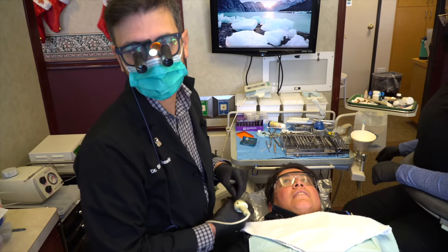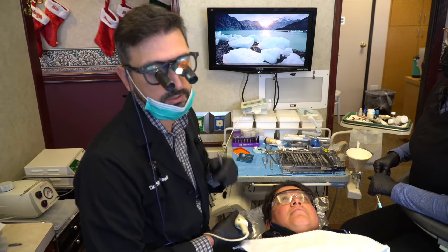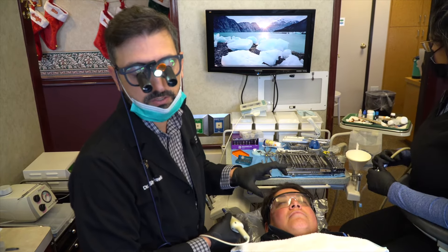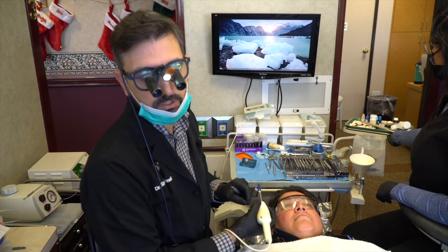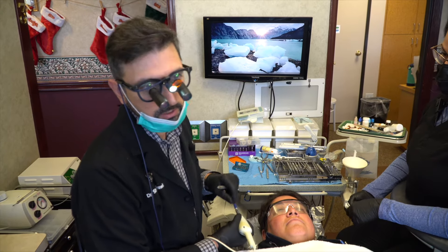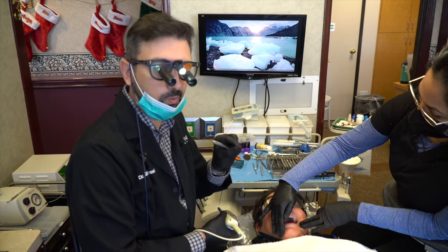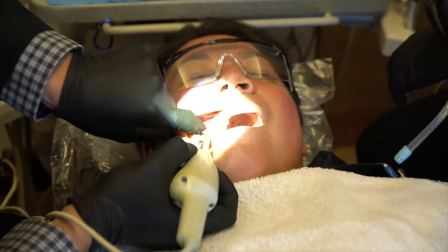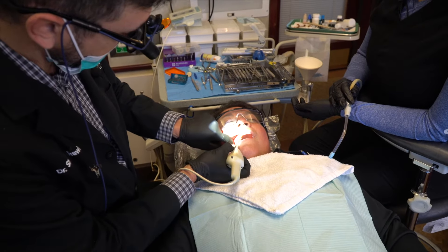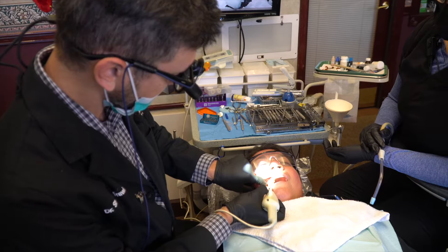We're going to get Jackie numb, and in our office it's important to do that as comfortably as possible. Nobody likes to get a shot, but there are ways to do it that are more comfortable than others. One of those is putting a topical gel on first to numb the outside, and then we use a mechanized anesthesia system to deliver the anesthetic in a very controlled, slow fashion so that it's more comfortable to the surrounding tissues. It also stimulates the area through a shaking technique that gives feedback from the nerves around the area so you're not focused in just one spot. This tooth has been root canal treated so there's no nerve in it — we're mainly numbing the gums, which are a bit inflamed because of the poor crown fit and the bacteria present.